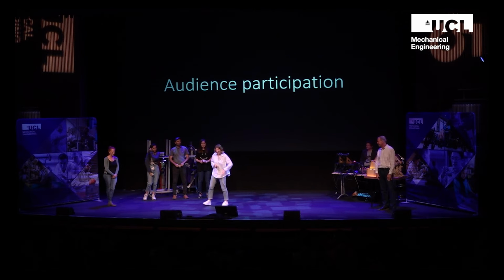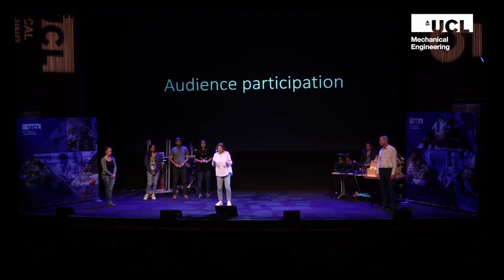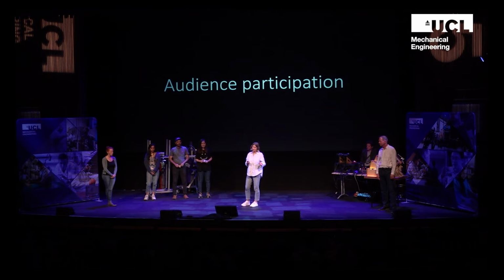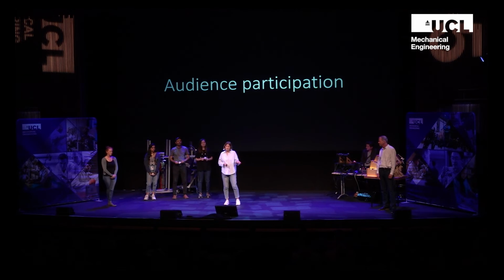Now, if I'm going to take a biopsy, I know that this is the area that I'm mainly interested in. However, I can't biopsy the whole area. If I take a section here where nobody put their hands up, I might then look at that under the microscope, and it's going to look like a slightly healthier area or a very healthy area, and it's very misleading because we're not getting the full picture. So how do we overcome this? Well, HiP-CT can overcome this, which is what we've just spoken about.